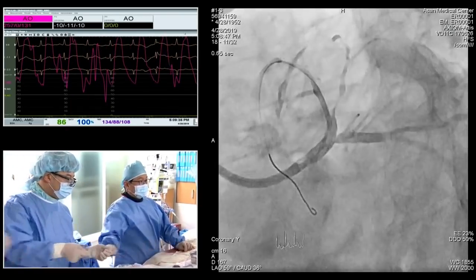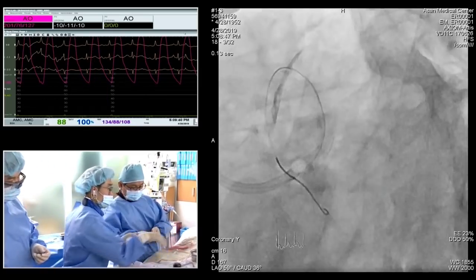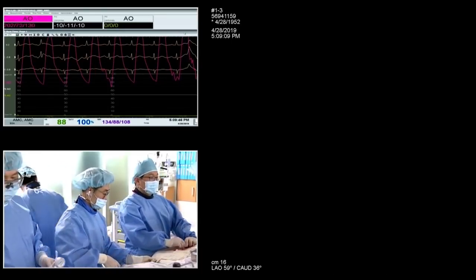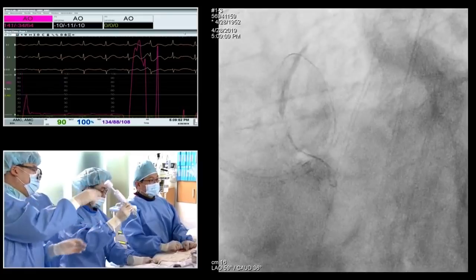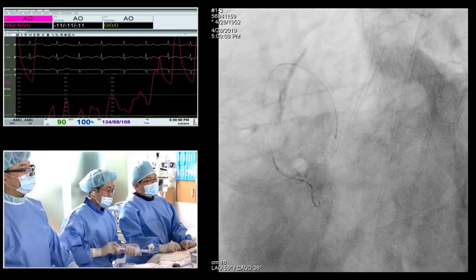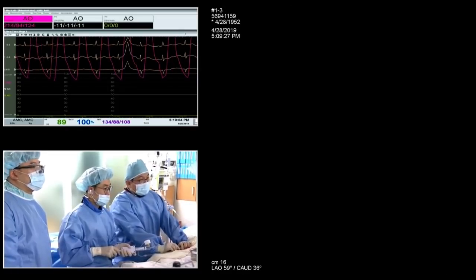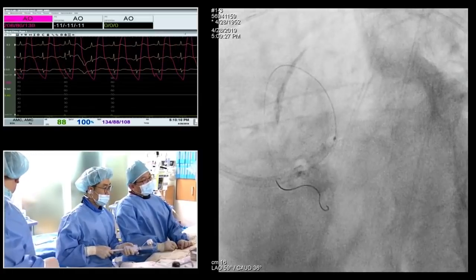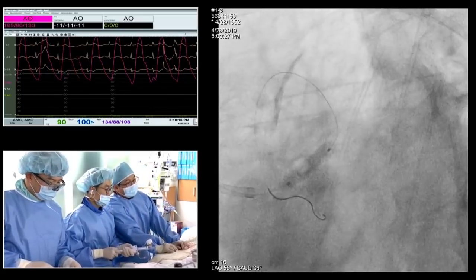So I think many interventionists are talking about, we have to recross the wires, proximal and distal. To be honest, in fact, we didn't care about that one. After the balloon crushing, the proximal part is very minimally crushed, and recross the wire is always biased from the visual things. Yeah, it's actually after balloon crush, the proximal cell is different from the original proximal cell. Proximal cell has been crushed, so it's between proximal and the middle cell.